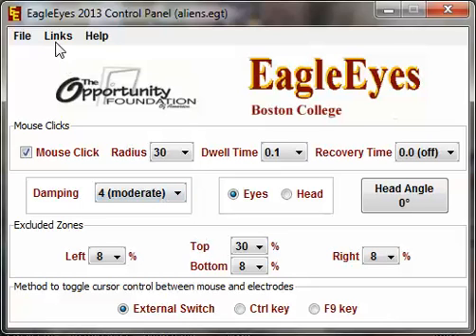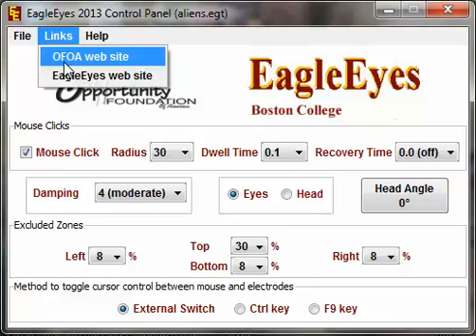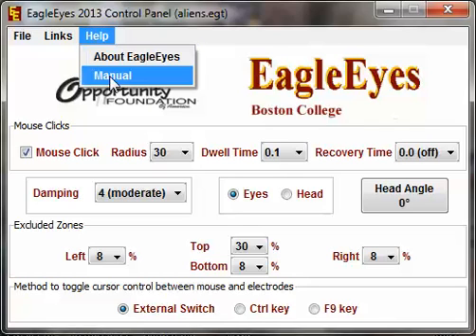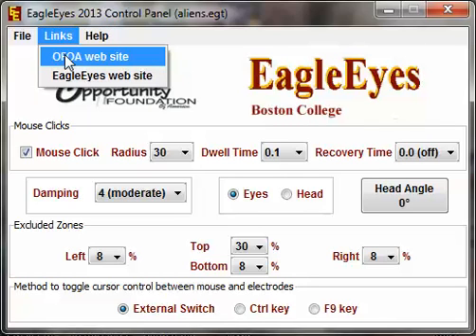Under Links we have the Opportunity Foundation website, where you can find training videos, help manuals, tips and tricks, and a new activity library with links to online activities you can use with EagleEyes. The EagleEyes website now forwards to the Opportunity Foundation website, so that is your resource for everything you need. The Help menu also has a link to the About EagleEyes page and the manual, which you can also find on the website.